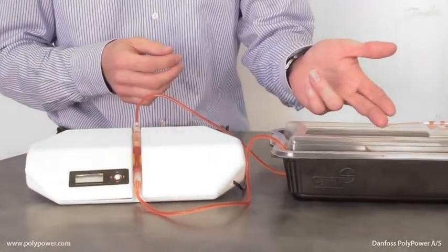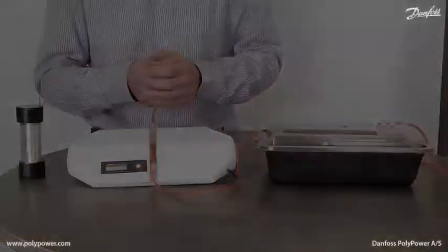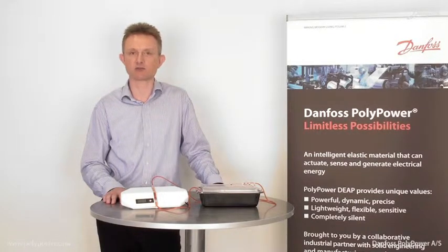Over here you can see how the fluid is pumped. Dosing and mineral pumps are widely used in the medical sector as well as in biotech, pharma, and other processing industries.